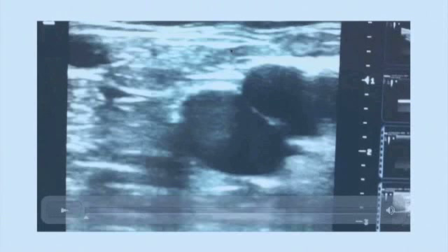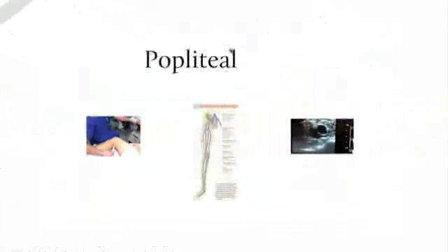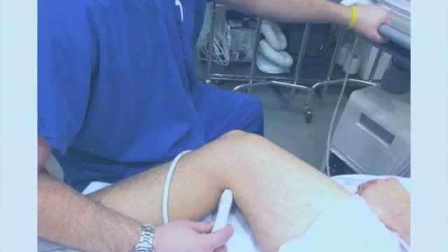So the second point, popliteal. And this is actually my leg. Your landmark for this, you're going behind the knee, which is not a hard landmark to find. And I guess it depends on where you practice. Back where you're from, Mike, South Carolina, maybe it's hard to find the knee. People don't have knees. Sometimes.